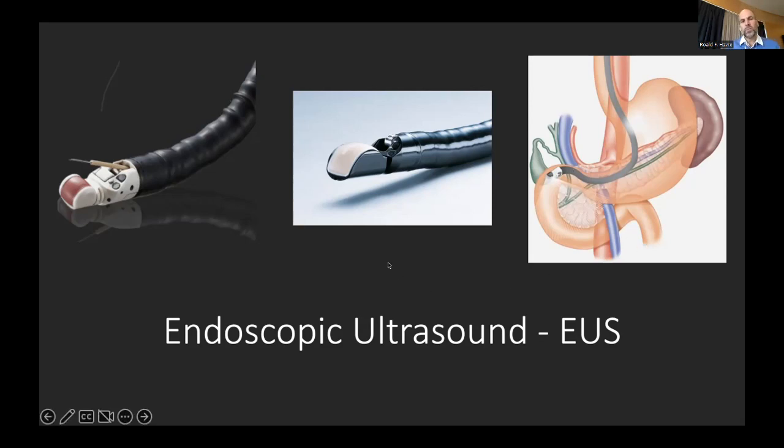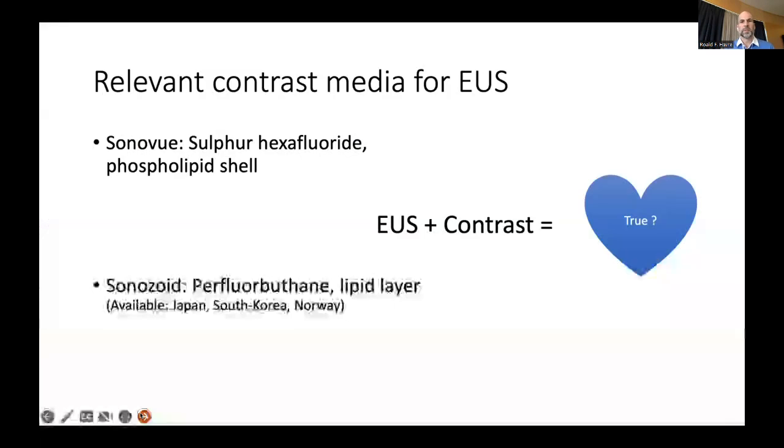Of course, when we emit sound from these, the crystals in these arrays are very much smaller. So you can compare it to listening to the treble speakers of your sound instead of listening to your bass speakers. While the external ultrasound are the bass speakers, these are the treble speakers. So we have to use some more energy, even if we deal with delicate bubbles.